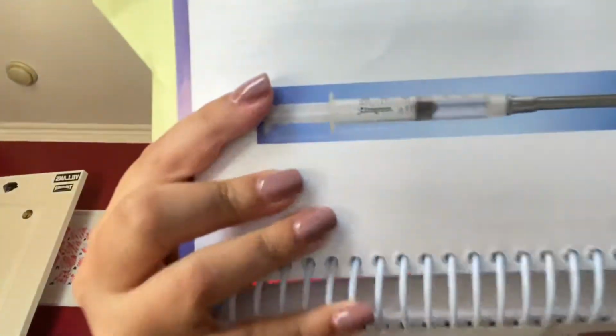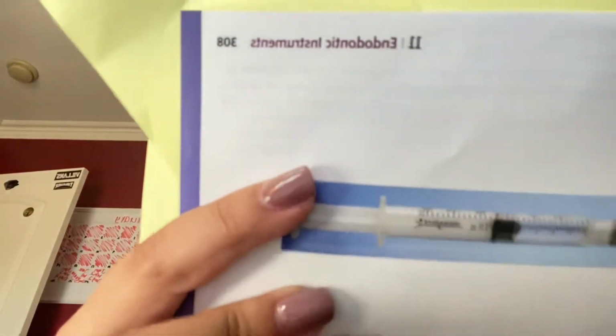And then after this, we're going to make sure that we're constantly irrigating the canal with an irrigation syringe. We can use hypochlorite, which is bleach, or hydrogen peroxide, and it's just a regular irrigation syringe, just making sure that we are cleaning the canal so dentin doesn't build up. This helps stop bleeding, and this also does help disinfect the canal.